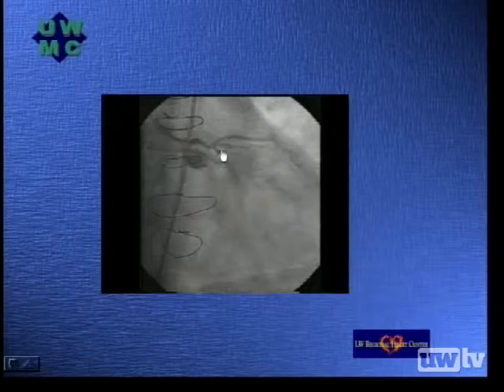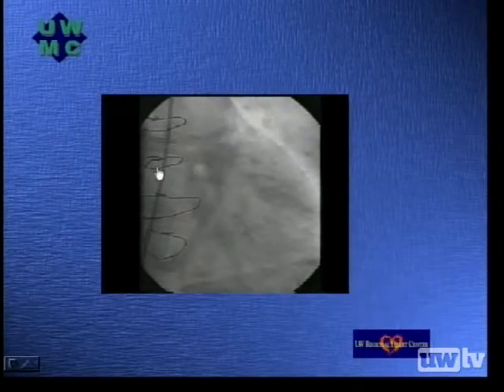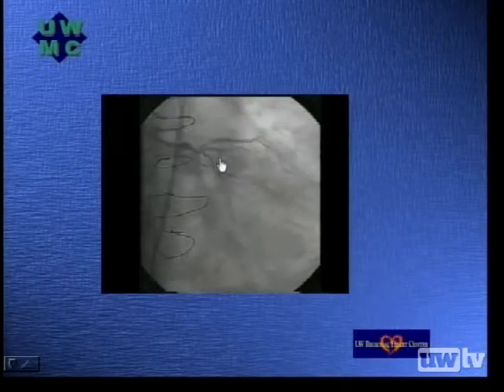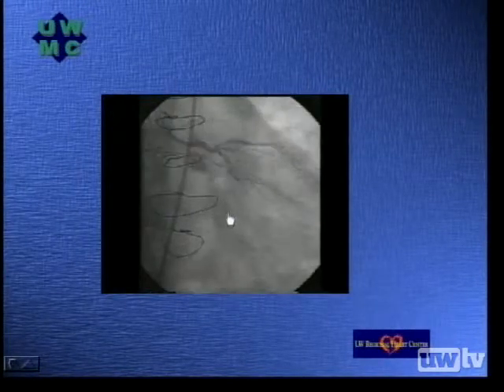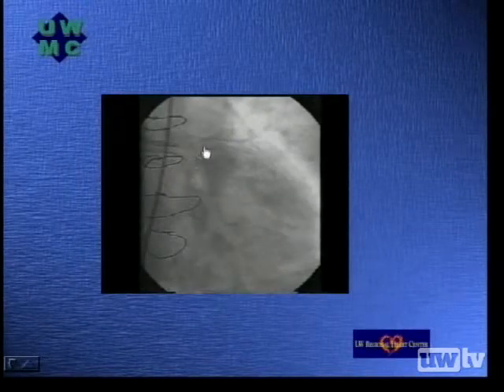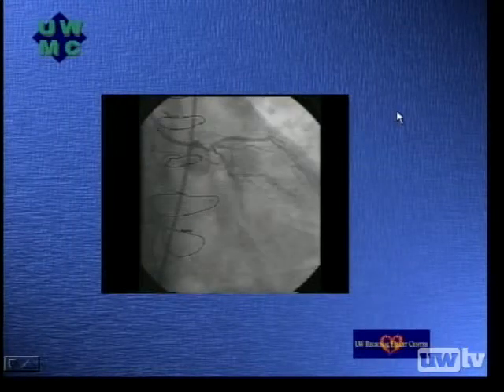This is our angiogram of the left coronary artery. Here we can see a significantly stenotic circumflex artery. This artery has been stented. The location of the stents are approximately from here to here. We can also see distally TIMI grade 2 flow. The location of the LAD would have been here if it were not occluded. However, the LAD is proximally occluded and thus it is not seen.